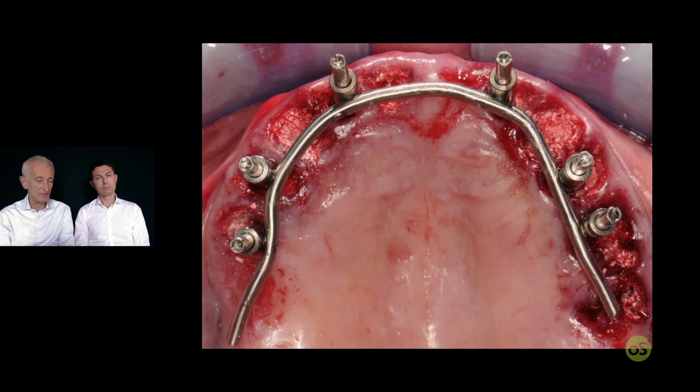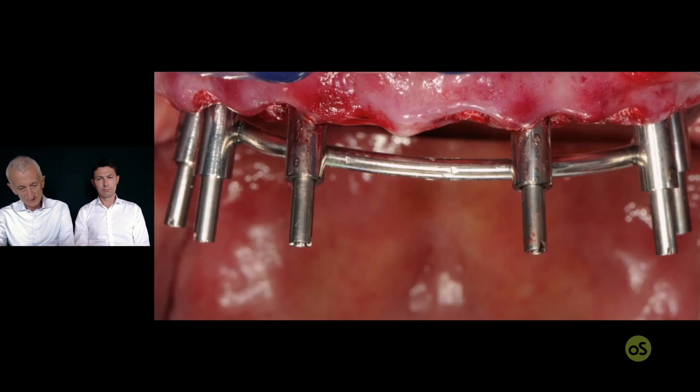You don't jump from one side to the other, always to the next adjacent abutment, so you do not introduce any tension whatsoever. And finally, you have finished. This procedure is not going to take you more than half a minute. Okay? It takes more for me to explain, but it takes 30 seconds.